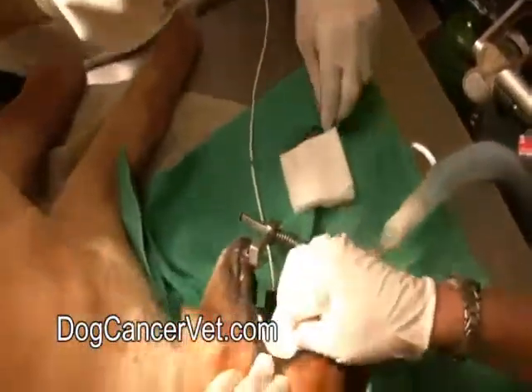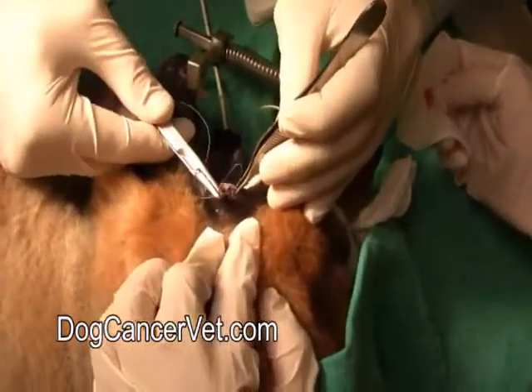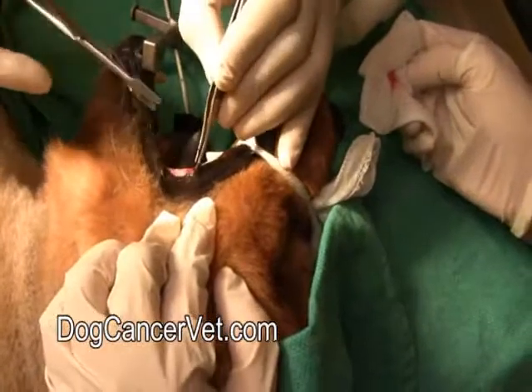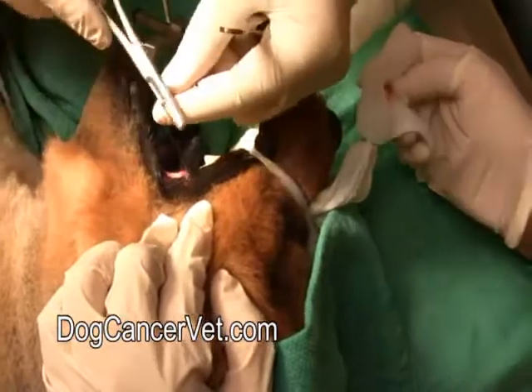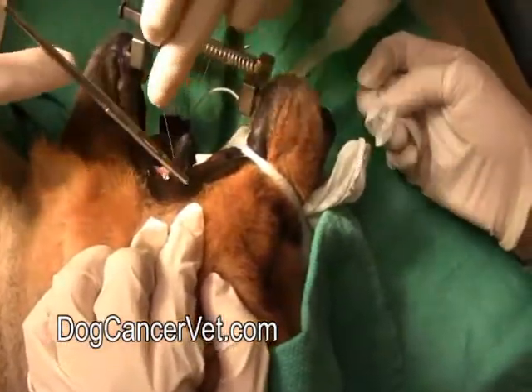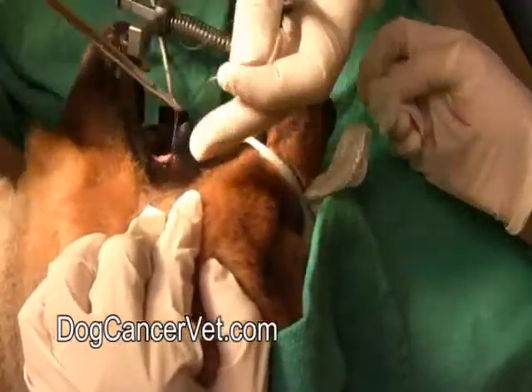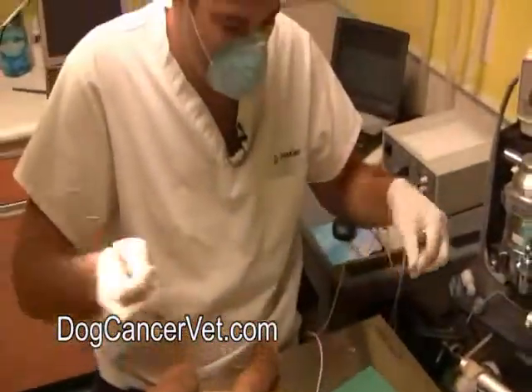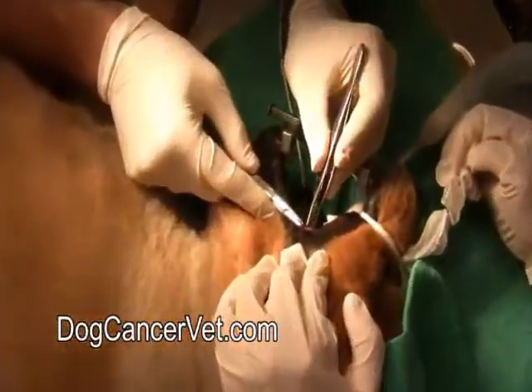I'm just going to dab it off a little bit there because there's a small amount of blood. I'm choosing a suture material here that will get absorbed by the body, and the reason for that is I don't want to have to go back in and take these stitches out because it's not very fun for the dog. So I'm going to use this stuff called Vicryl - the body will break this down in about six weeks and we won't have to deal with any suture removal. I'll put one more stitch in there just to make sure it doesn't come open during the time that it's been healing.